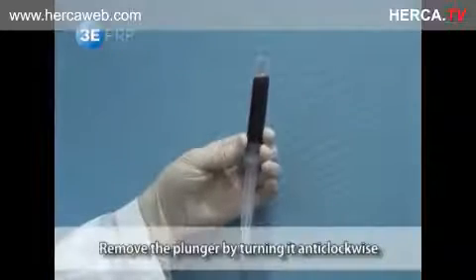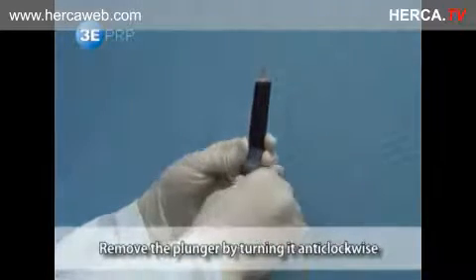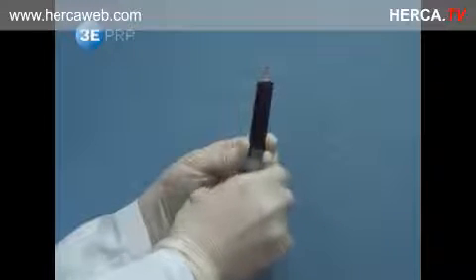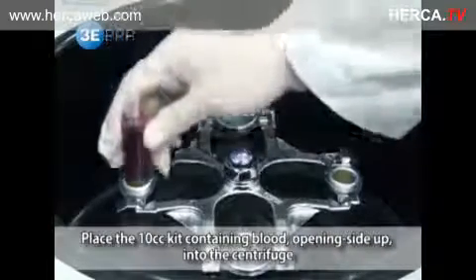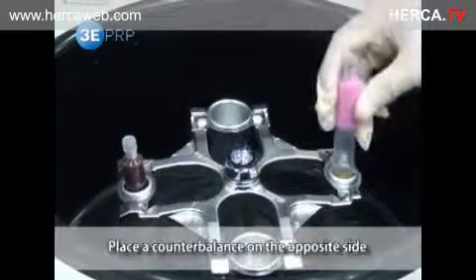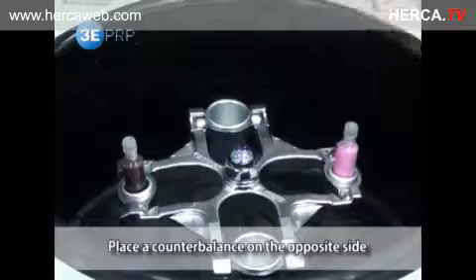Remove the plunger by turning it anti-clockwise before placing it in the centrifuge. Place the 10cc kit containing blood with the opening side up into the centrifuge, and place a counterbalance on the opposite side. Weights should be matched on both sides to prevent malfunction of the centrifuge.